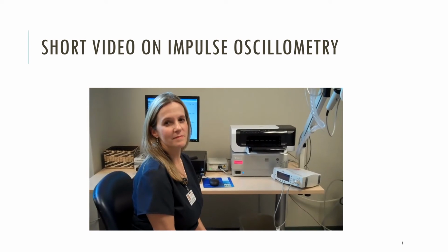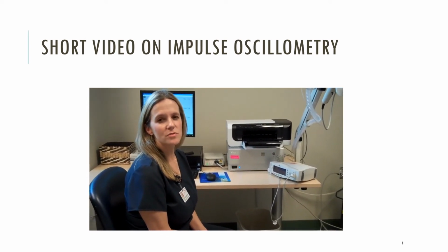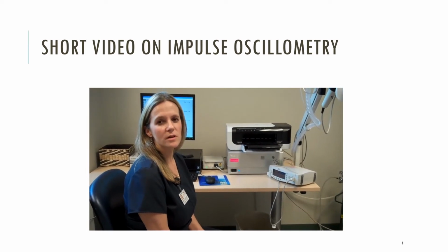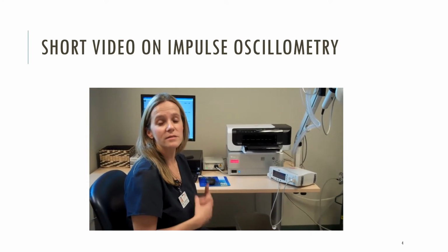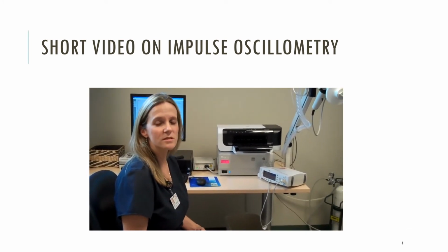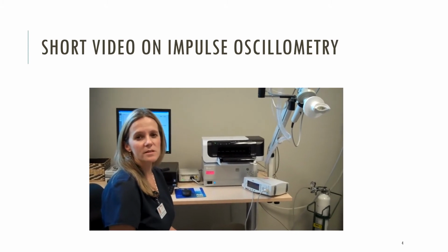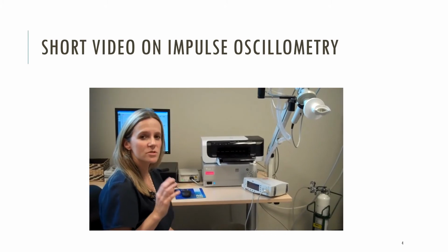Tell me about the impulse oscillometry system. IOS is a test that's used to detect lung disease. It's a much more sensitive test than spirometry. Spirometry is used as a pulmonary function test and is also a breathing test. It is used to detect lung disease, but the IOS is a much more sensitive test, and it's offered here at the St. Tammany Parish Hospital Outpatient Pavilion. The test takes about 20 to 30 seconds, and you'll do a minimum of at least 3 trials.